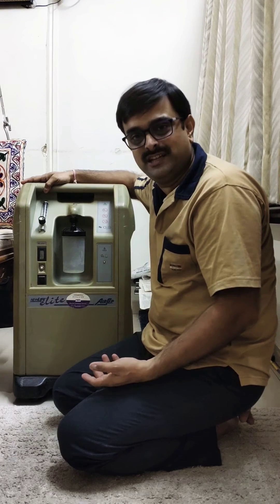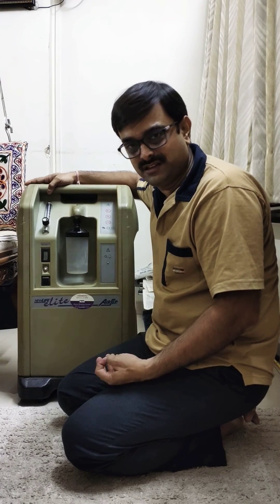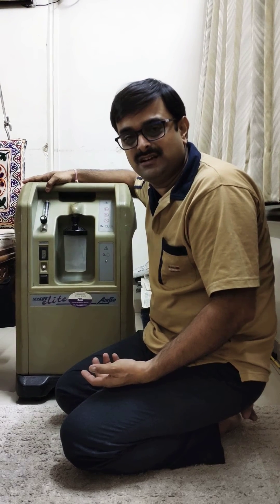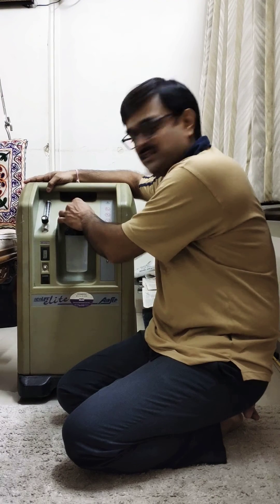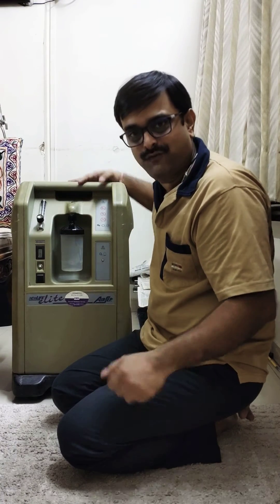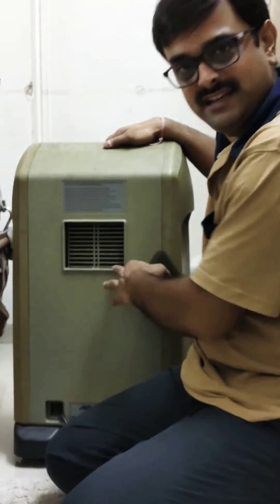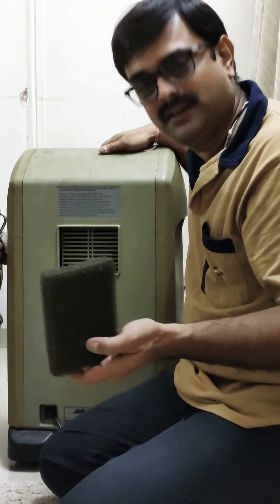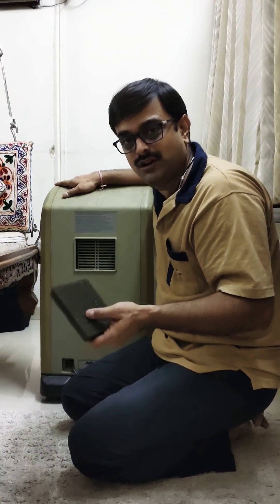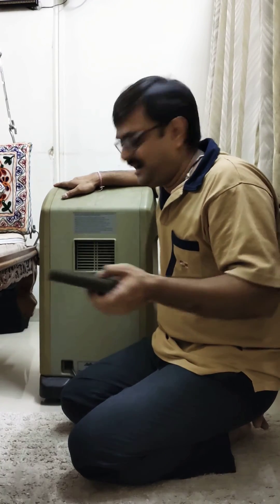Now in this video, I am trying to explain a few troubleshooting tricks — what you can do when you have an issue with the machine. The most common issue is that the machine is not giving enough pressure of oxygen. The most common fault in that is this inlet filter. This is a filter which is attached here, and it is supposed to block all the dust. So whenever you are facing an issue of pressure or force of oxygen, just take this filter out, dust it somewhere outside, and clear the dust, then you can refix it.